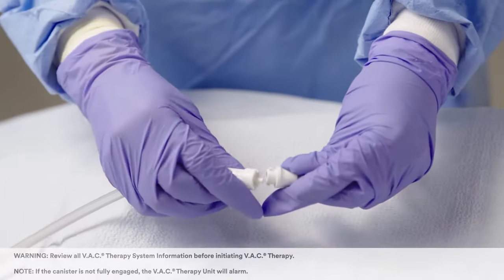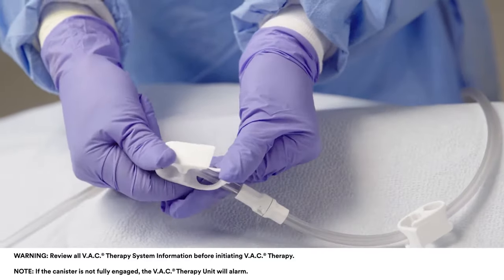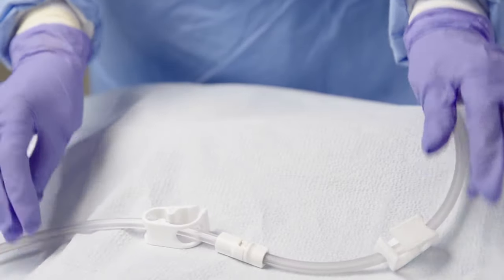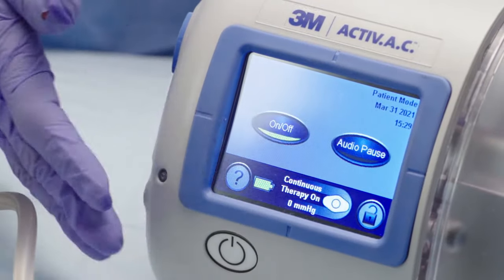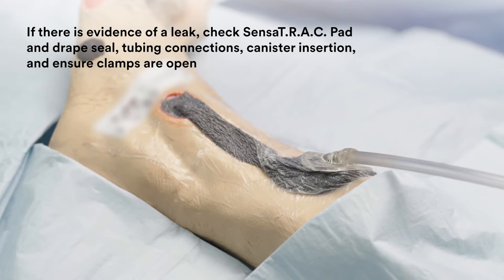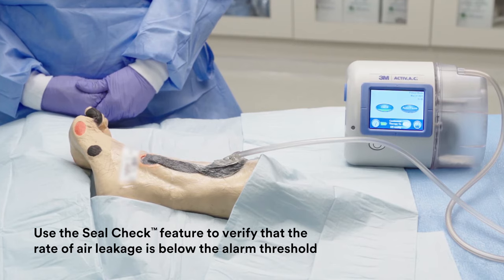Connect the sensor track pad tubing to the canister tubing and ensure the clamp on each tube is open. Position clamps away from the patient. Turn on power to the VAC therapy unit and select prescribed therapy setting. Assess the dressing to ensure seal integrity. The dressing should be collapsed and have a wrinkled appearance. There should be no hissing sounds.